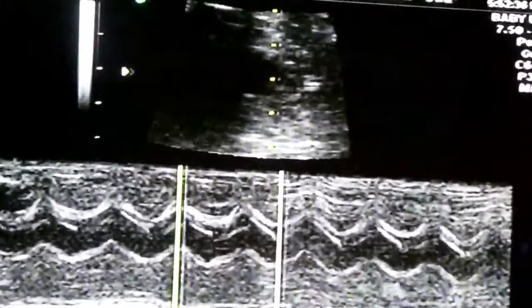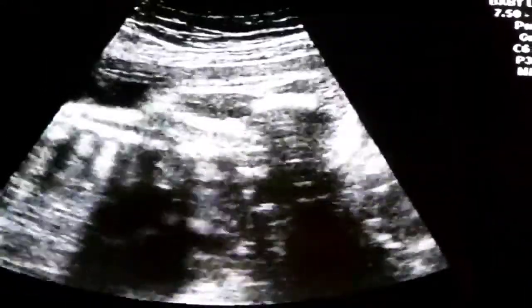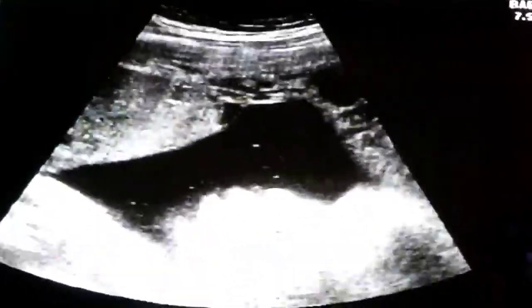I have a roundabout way of looking at her here. 143 — perfect. Anything 110 to 160 is perfect. You can see her breathing. You can see her heart. She's head down, facing the side. Your placenta's in the front. She's still a girl.